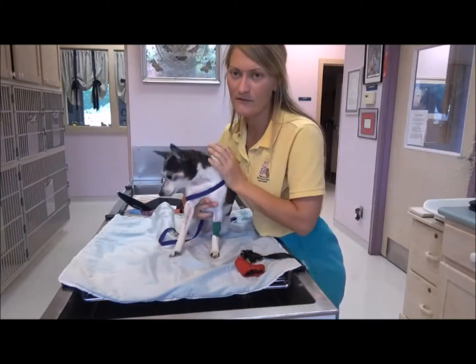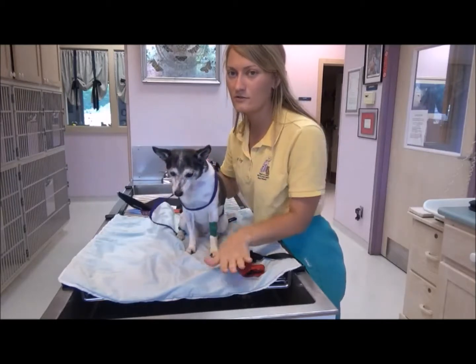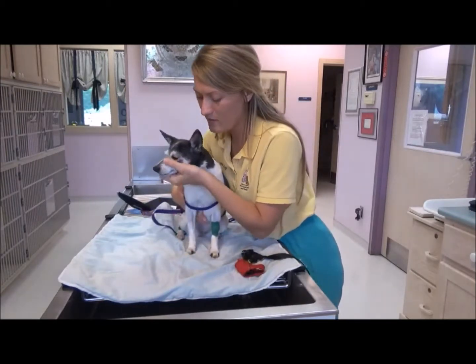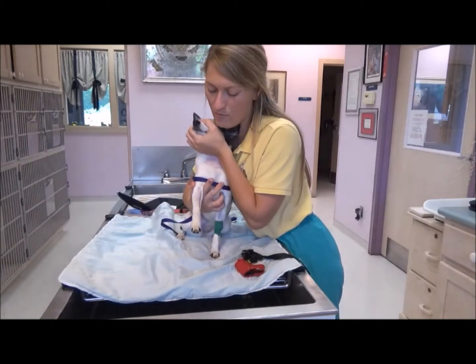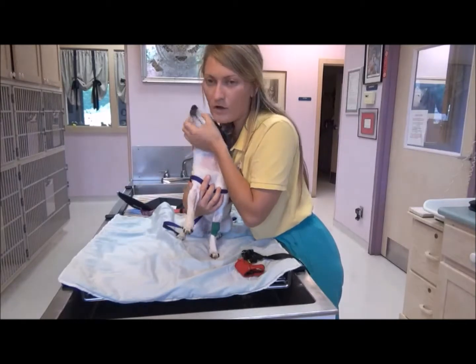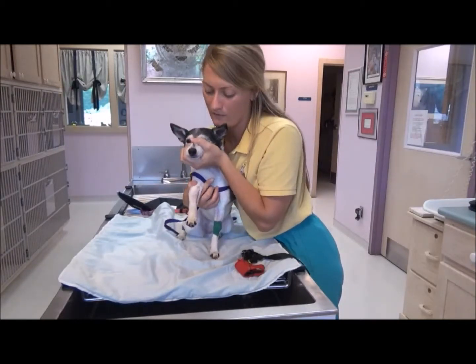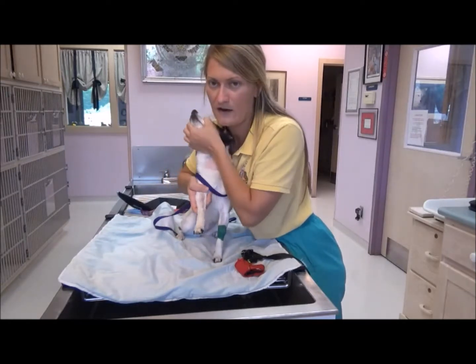When collecting a cephalic blood sample, they can once again be sitting or in sternal recumbency. And then you want to hold under the chin with one hand and then hold behind the elbow of the leg where the blood sample is to be collected, while you're also somewhat extending that leg forward. And then at the same time you want to roll the vein out.